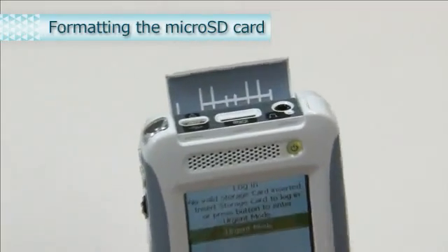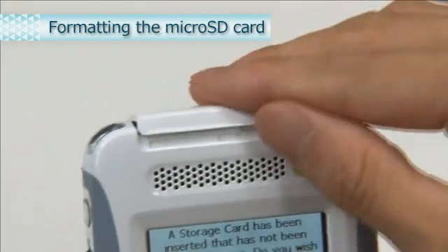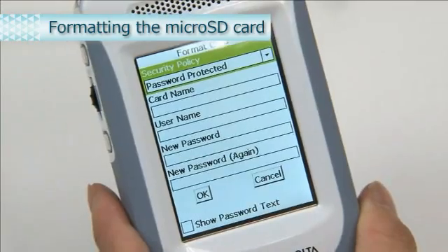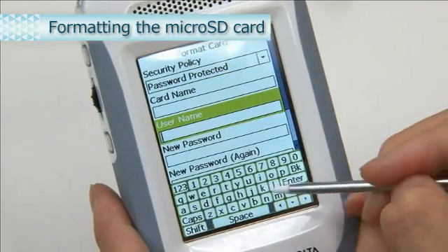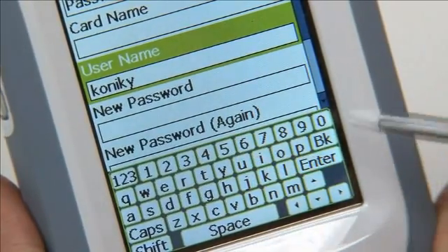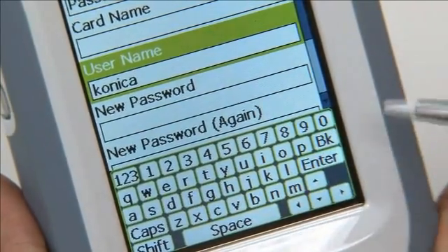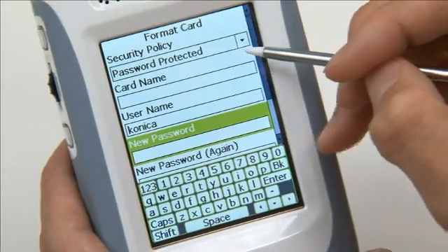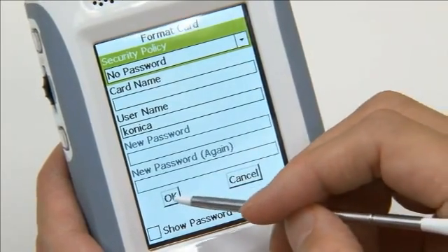Next, format the micro SD card. Open the lid on the top of the display unit and insert the micro SD card. When the screen appears, select Yes. The format card screen appears. Be sure to enter the user name. If you make a mistake while entering, use Backspace to delete, then enter the information again. Enter your desired password and card name. If you do not wish to enter a password, select No Password, then select OK. This completes the formatting of the micro SD card.